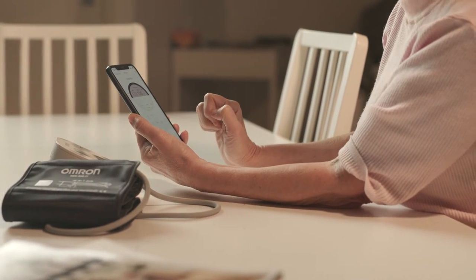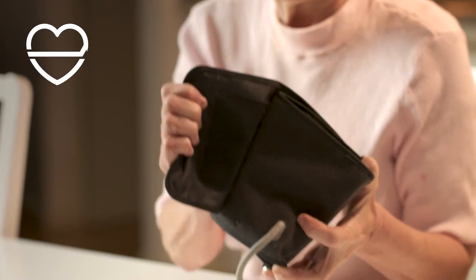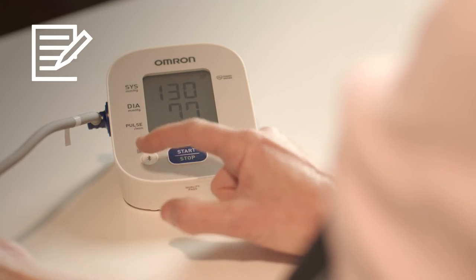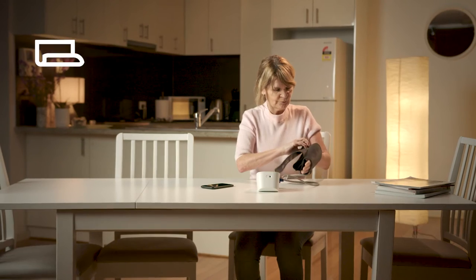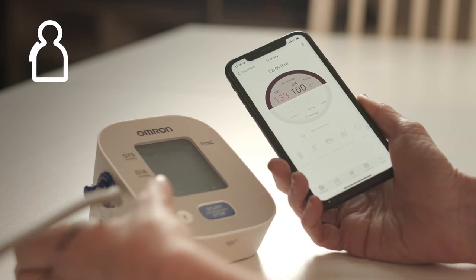Features include Bluetooth connectivity via the OMRON Connect app, IntelliSense technology, irregular heartbeat detection, 30 measurement reading memory, hypertension indicator, wide-range soft cuff, cuff wrapping guide, and body movement detection.